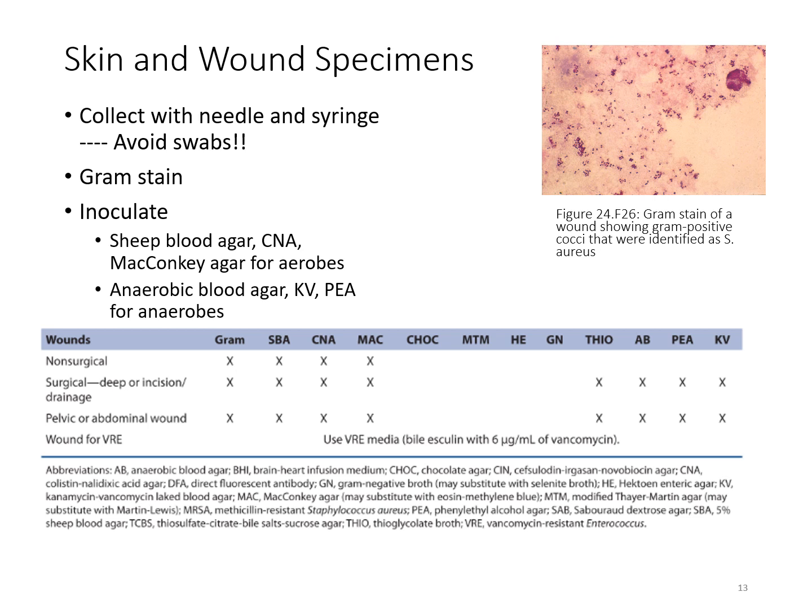These cultures may require you, depending on your site, to do a gram stain of that particular specimen. Here you can see a gram stain of a wound in which there's a lot of gram-positive cocci present that ultimately led to the identification of Staph aureus. And in the background here, you can see a lot of debris. So the gram stains in micro can be a little confusing when you take it from direct specimen sources. Because you do have that little bit of debris that does stain, it does make it a little bit harder to recognize, but this is a pretty good stain here.